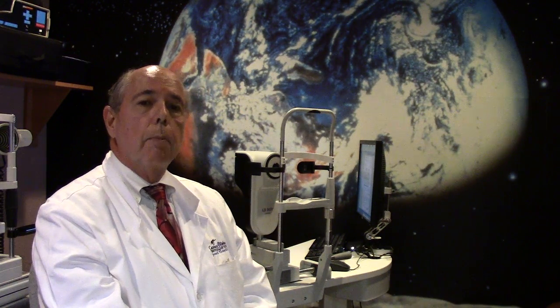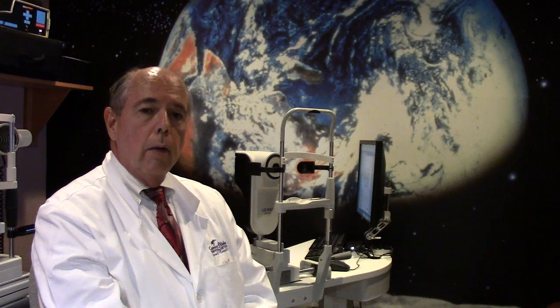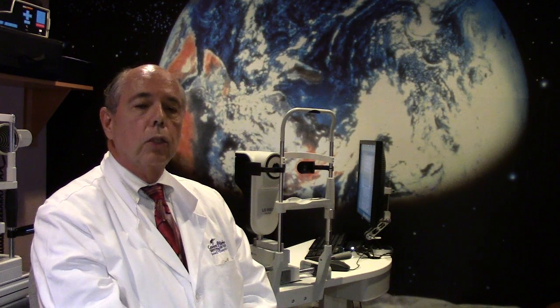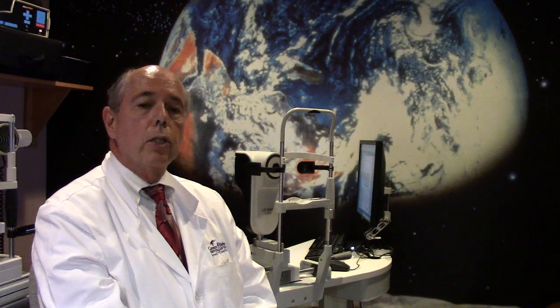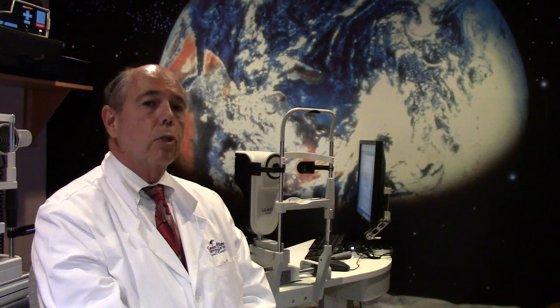So with this type of lens which we call a toric intraocular lens, we were able to correct her astigmatism. And it's just recently that we had a lens that would be strong enough to correct six diopters of astigmatism.